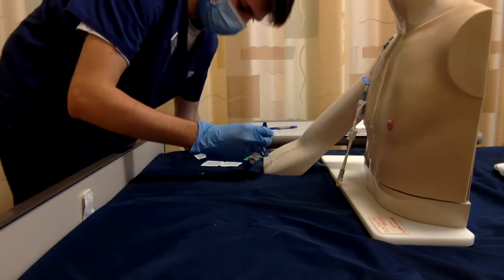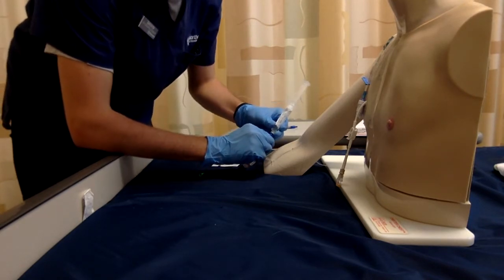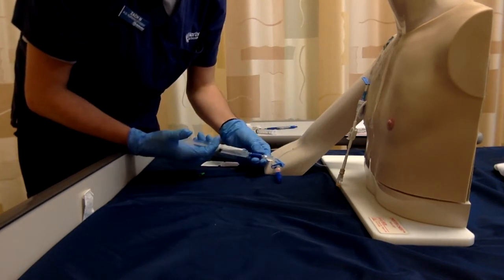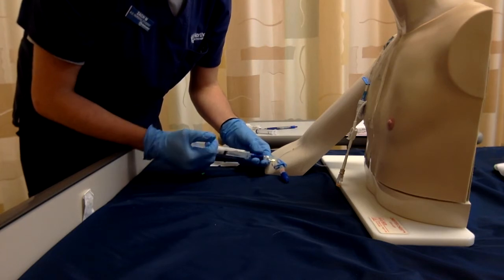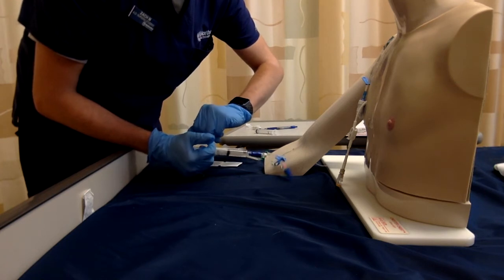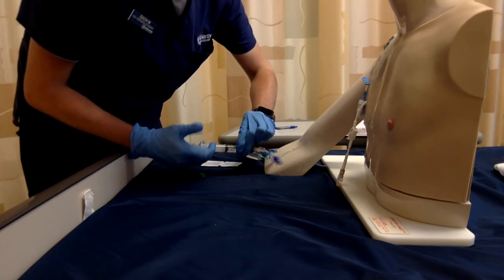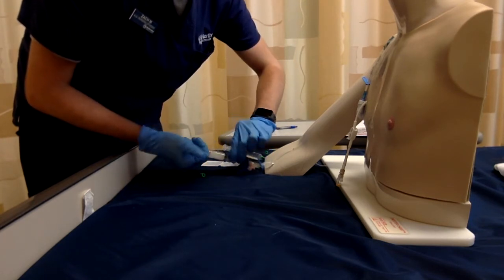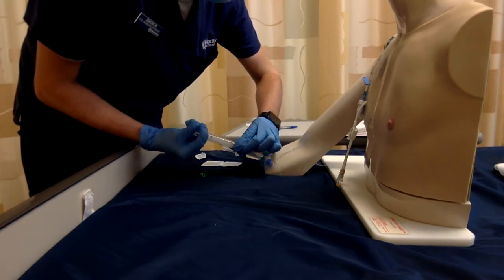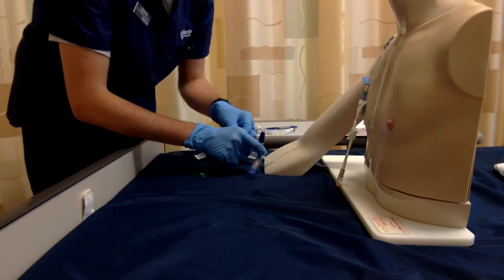And now I'm going to use the medication, which has to be pushed over 2 to 5 minutes. So, like I said, 2 to 5 minutes. Slowly pushing it in. I'm just going to speed it up for the time being, but I would obviously push it in over 2 to 5 minutes. Pulsating again. And I'll do my post flush.